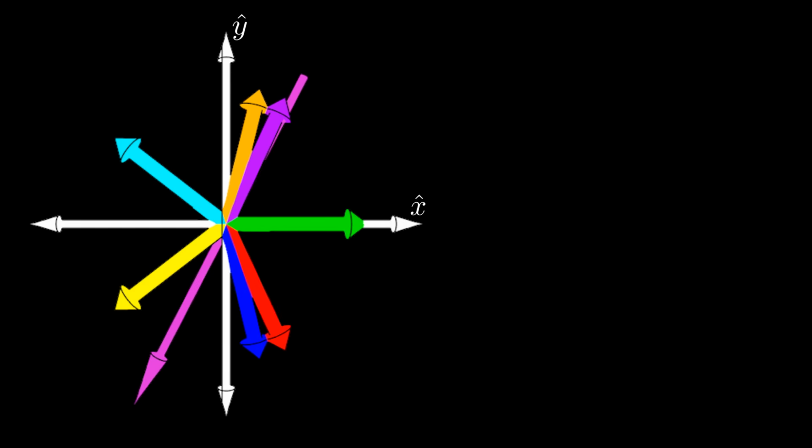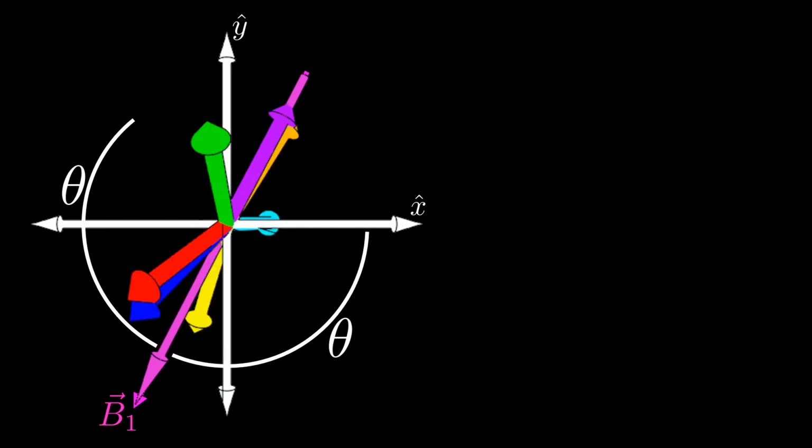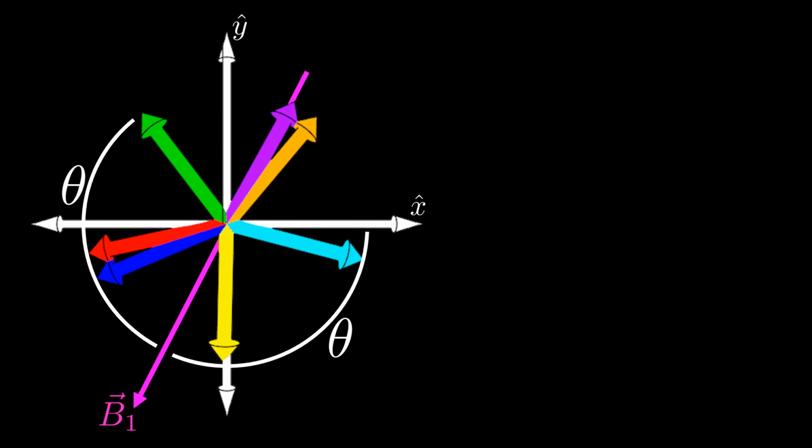Here's my dephased spins immediately before the 180. Notice the angle our green spin makes with respect to the B1 field. Following the 180, our spin will be at this angle on the other side of B1. Thus, we can expect our echo to be at twice the phase of our B1 pulse relative to the magnetization vector.